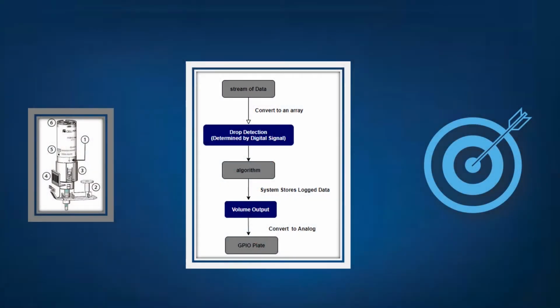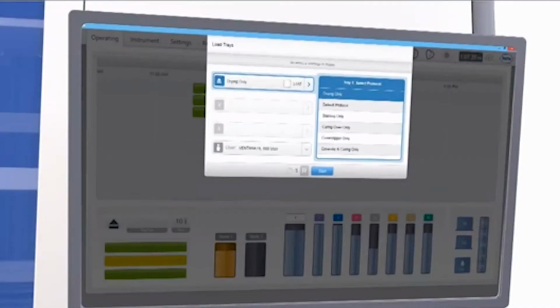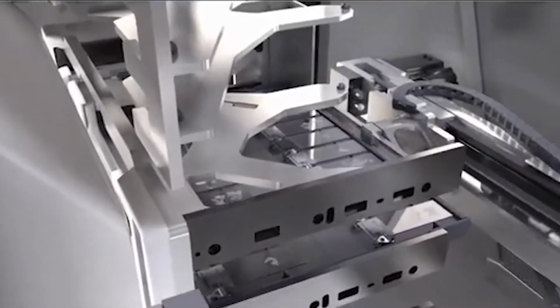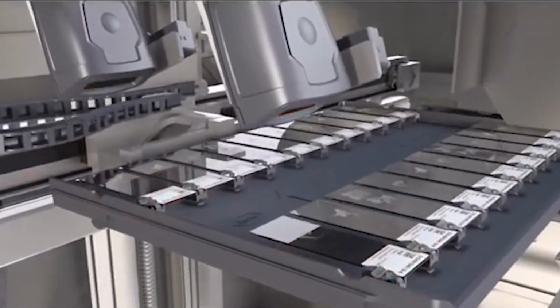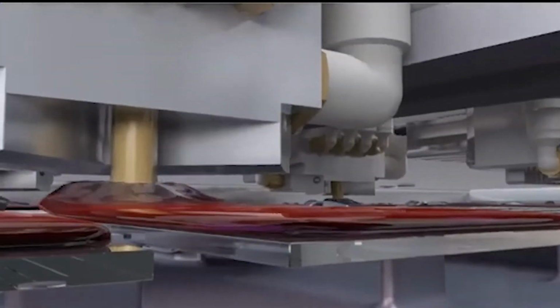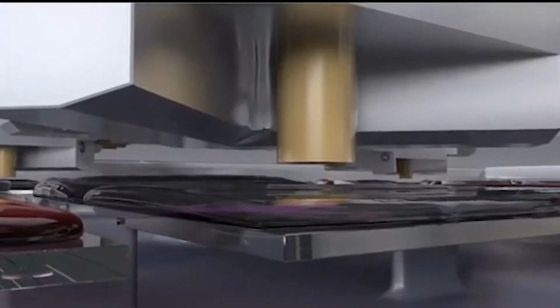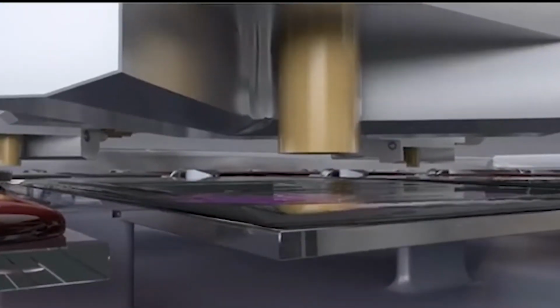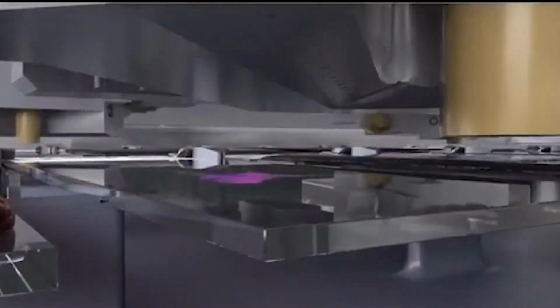The drop volume system provides Roche with higher accuracy for patient diagnosis. Currently, Roche uses the Benchmark Ultra, a staining system to detect patient diagnosis. To deliver the most precise and accurate diagnosis, the system needs to ensure that the proper quantity of reagent is being dispensed on every sample. If the amount of reagent is insufficient, our system could provide a volume output to Roche technicians for validation. This brings awareness of the system imbalances and errors prior to delivering diagnosis.